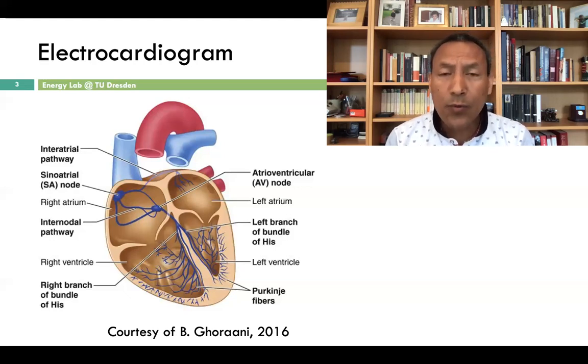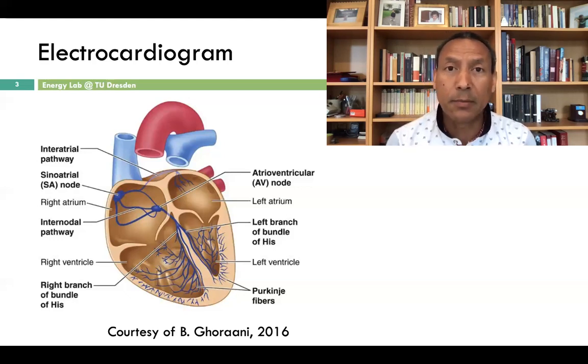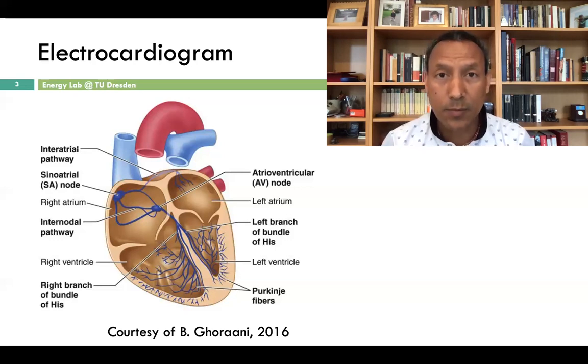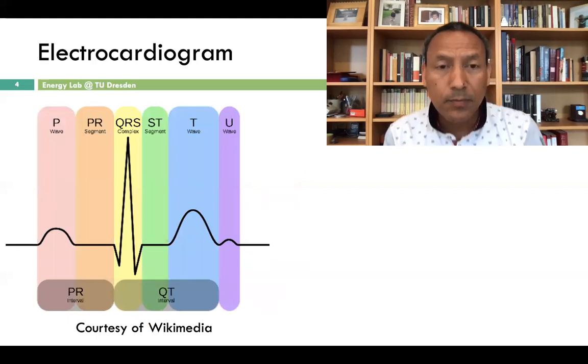If any of these electrical systems or the walls of the heart or the blood vessels are affected, then it affects the electrical activity of the heart. And by closely examining the electrocardiogram signal, it is possible to localize the problem and search for some remedy.